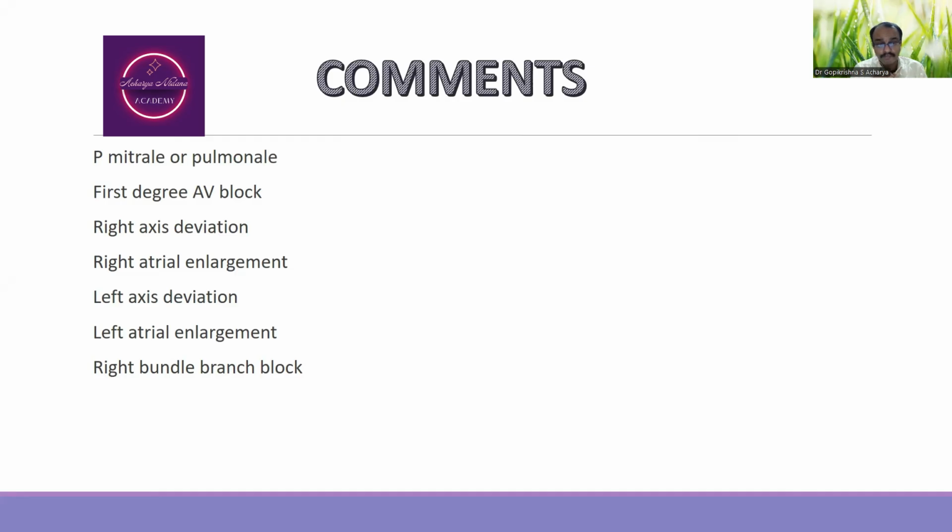P pulmonale, where the height of the P wave will be more, and P mitral, where the width of the P wave will be more. P mitral is indicative of left atrial enlargement, and P pulmonale is indicative of right atrial enlargement. In case of first degree AV block, the PR interval is prolonged. In case of right axis deviation, the electrical axis will be between plus 110 to plus or minus 180.